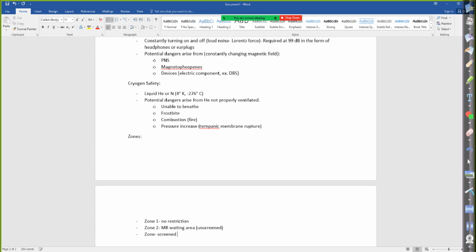By the proper person. By level 2 personnel. Okay. Can a level 1 personnel bring a patient into zone 3? No. Level 1 trained personnel cannot accompany, they can only keep themselves safe in zones 3 and 4. Okay. Just remember that, zone 3. And this is also the console area. All right, and then zone 4, that's our scanning room. Highest area for danger.